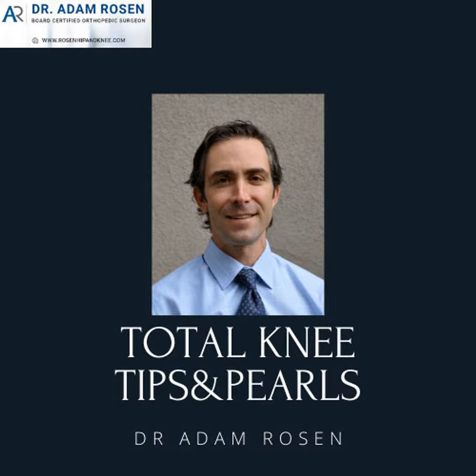the next thing that I tend to do is I'll get a set of flat osteotomes, and I tend to use a really small one laterally, and I'll put that in until I hit the keel or the post. And I'll use a really wide one from the center to the medial aspect, hit that in. And then I just give a couple hard whacks from below, hitting both of those osteotomes. And most of the time, it usually comes up.